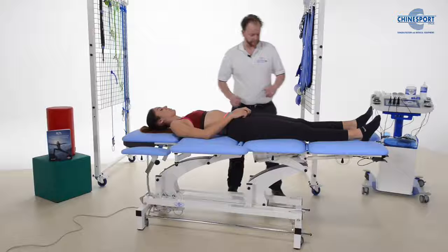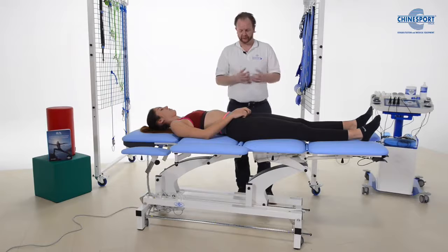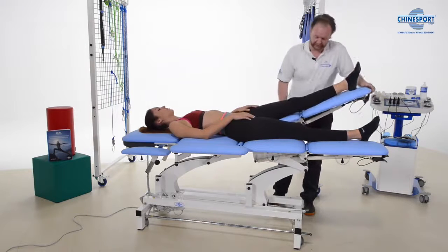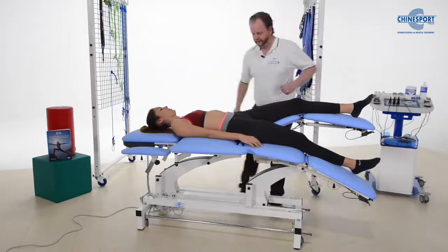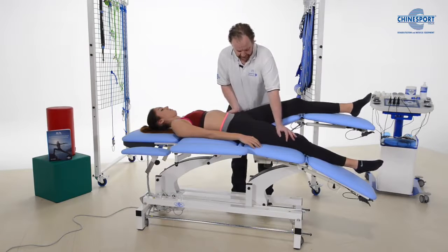In the next phase, usually what we try to do is we try to go into some stretching. People will often have problems with the psoas muscle, for example, so what we can do is we can bring up this side, we can lower that side, and we can go into a psoas stretch and just relax and continue breathing normally.